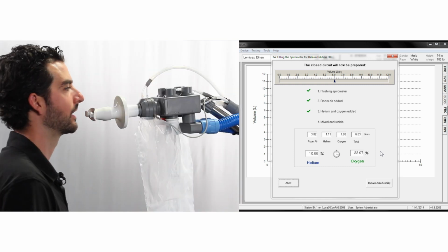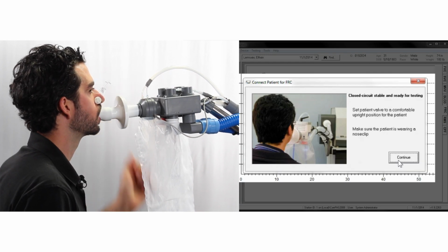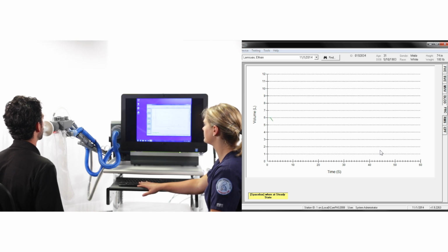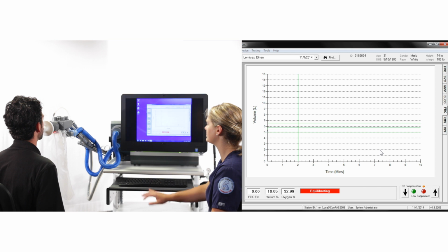The subject should be seated comfortably upright and be wearing a nose clip. Since the measurement being made is FRC, it is important to let the patient relax and be at a steady state before turning them into the spirometer. Press the space bar when you are satisfied that the subject's tidal breathing is stable. The program will look for the next end tidal breath and switch the patient into the closed circuit.